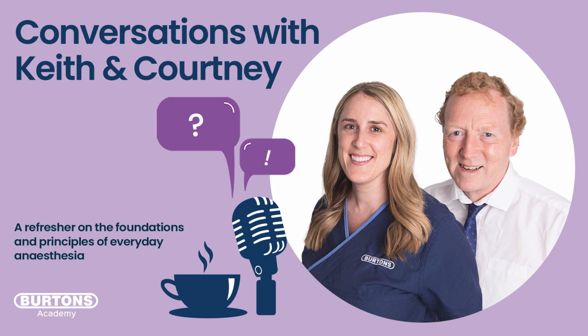So yes, the character of the capnogram is really important. And if you start to see disturbances in it and rounding off, then yes, a leak is one possible explanation, but also we're trying to monitor an animal on a side stream which is taking too much away from the circuit, or we're trying to monitor on a mainstream which has got too high a dead space. So absolutely right, the morphology of that capnogram is incredibly informative.